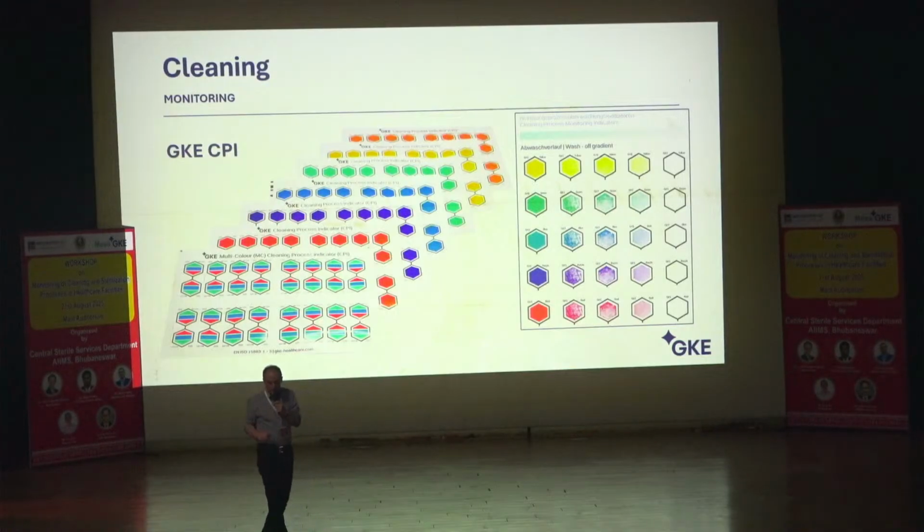Maybe you will have a combination product which has mild alkaline and enzymes in one setting. So we have so many different processes here in the room represented by you, because you are doing cleaning, and nobody can say I clean completely identical like the other hospital. Every process is different. And now, please put yourself in our position.